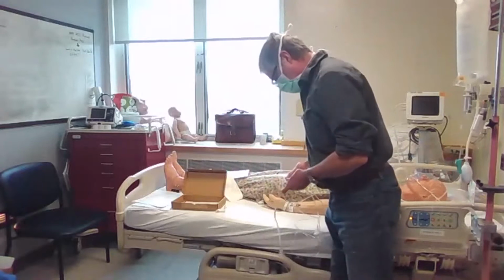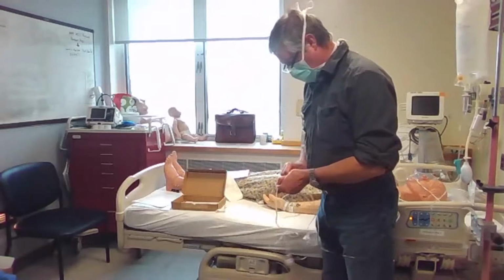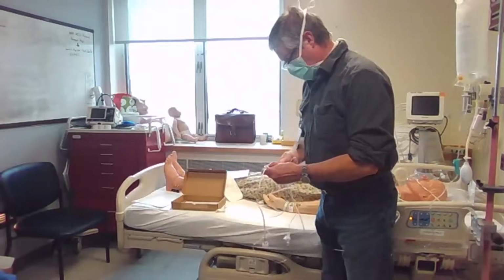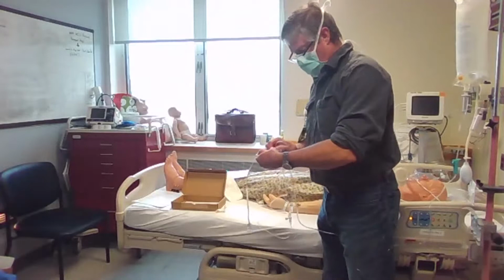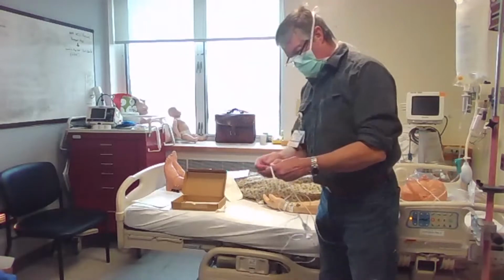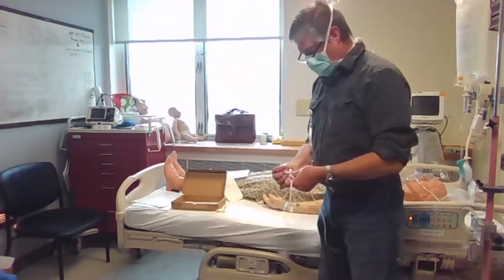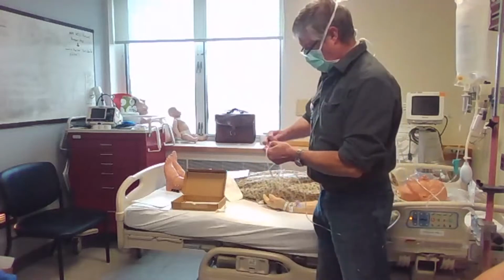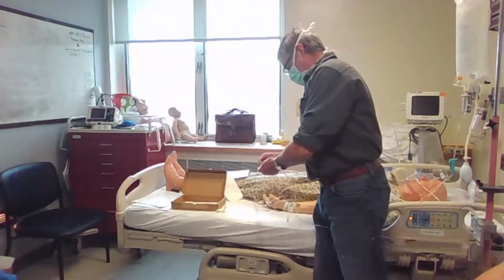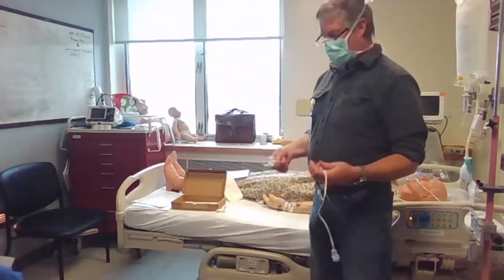So water comes out here. You come over here to the same one, you open it, which is easiest just to do. And you have to do that. So you open it, flush it. Open it quick here. It's always hard to remember which end is the right end. Close it to the patient. And it flushes there. Sorry about that with the stopcock.